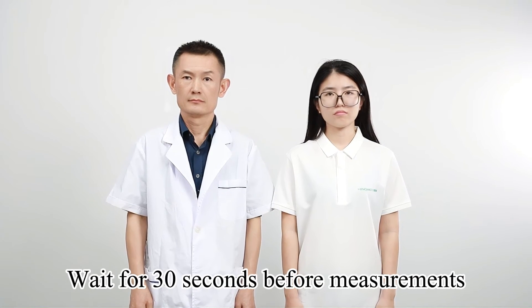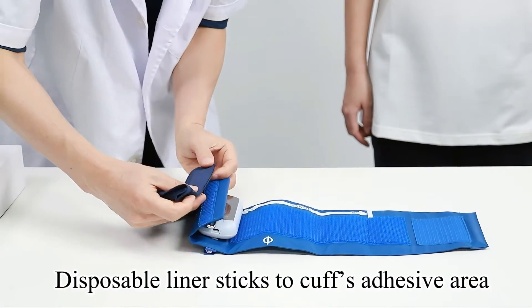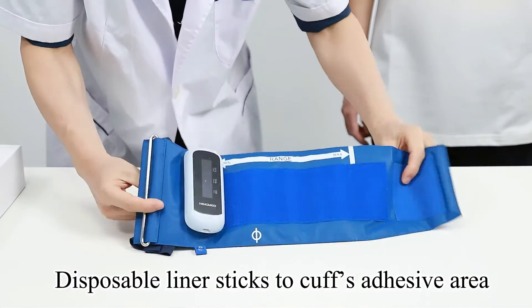Wait for 30 seconds before measurements. The disposable liner sticks to the cuff's adhesive area.